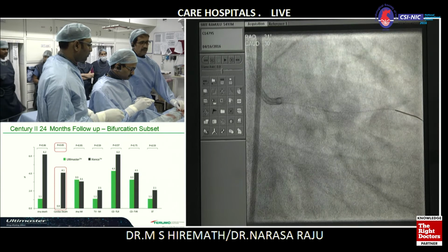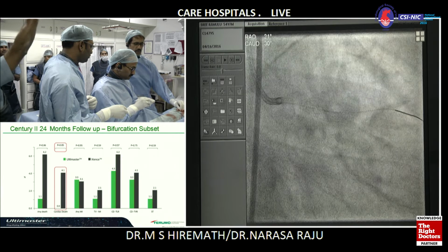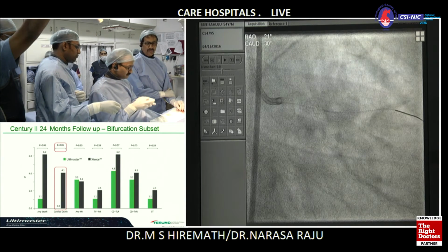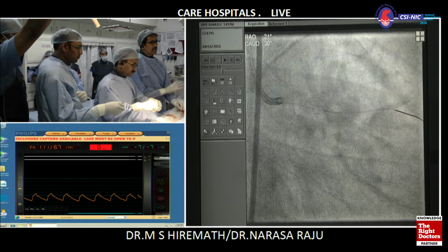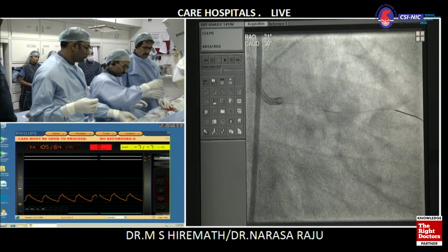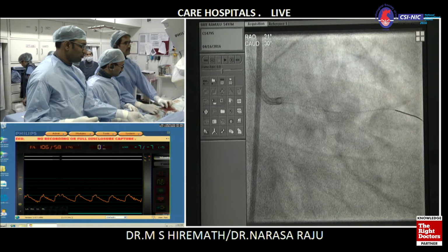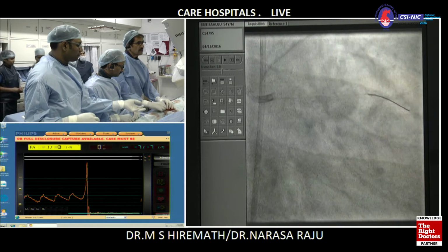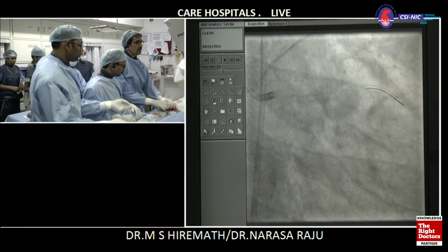So I'm going to ask you. We discussed a little bit because we knew that we did not have a 4.5 or 5.0 stent. So the next option we may opt for is to put one more wire and have 2 balloons and go up simultaneously in the back portion so as to stretch the stent. We very rarely do it, whenever a big balloon diameter is not available.